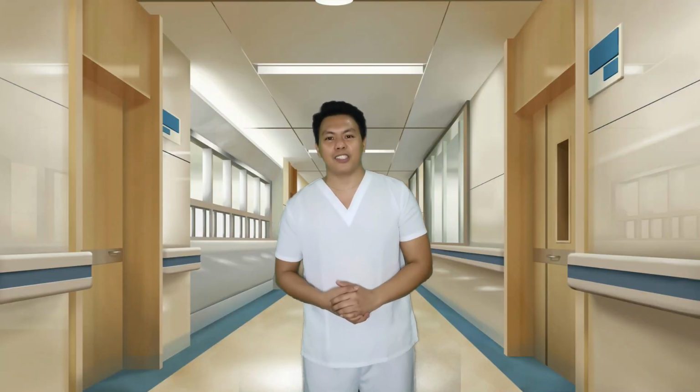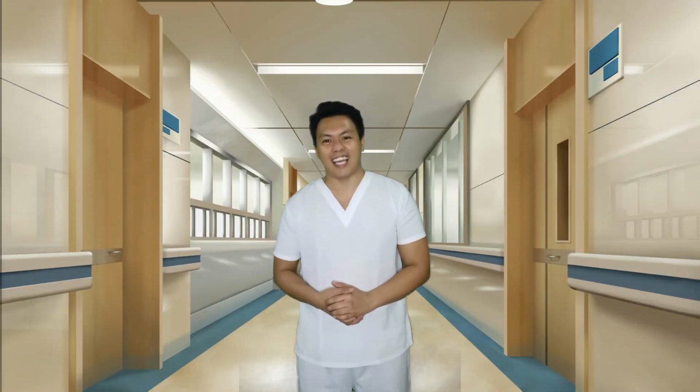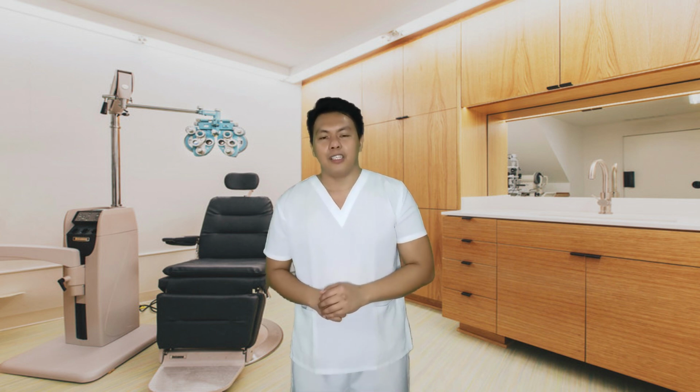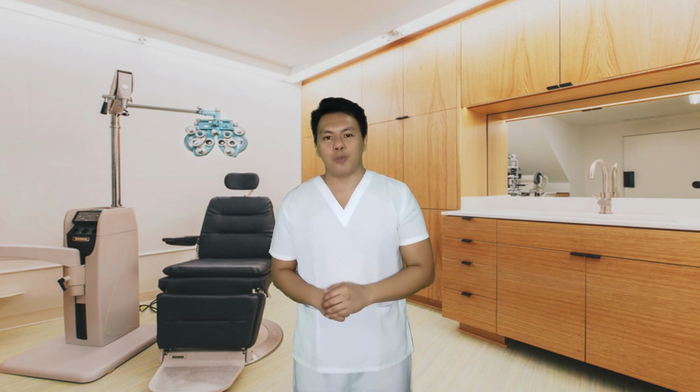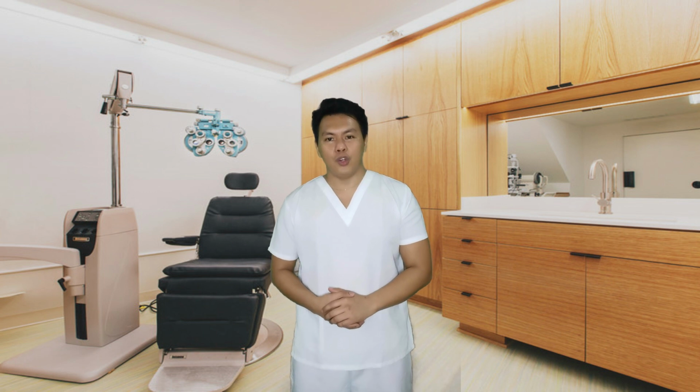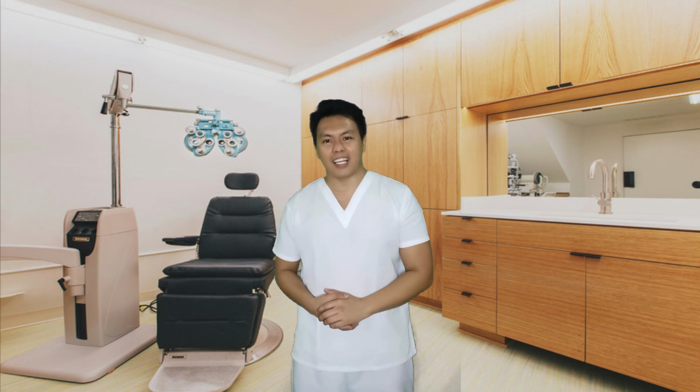Assess direct and consensual pupillary reaction to light. Number 28. Darken the room partially and ask the client to look at a distance. Number 29. Shine a light obliquely into each pupil in turn, using a pen light approaching from the side. Number 30. Look for direct and consensual reaction.